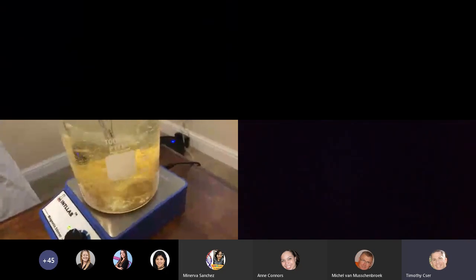So we've got our fancy science scooper here. Why don't you show the science scooper, otherwise known as an ice cream scoop. What we're going to do is pour media into these liter jars at the same time. Let's go. Excellent. Look at that. Now we've got all the media at the bottom, stirring, mixing.